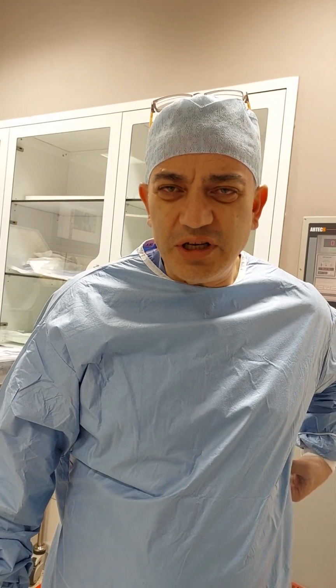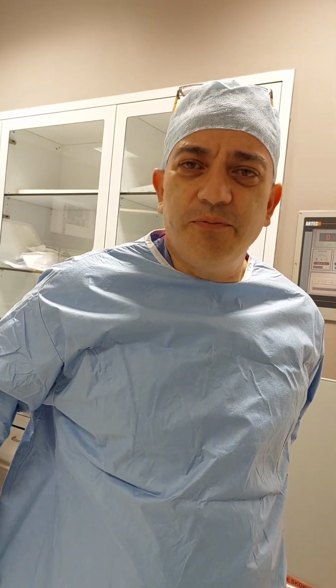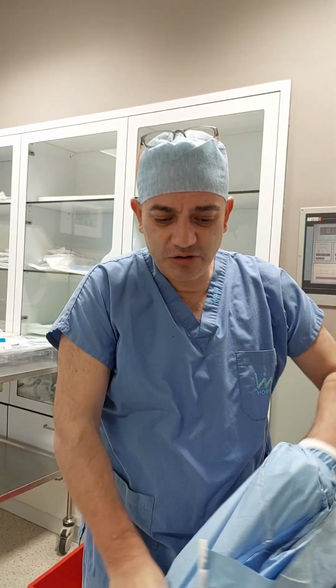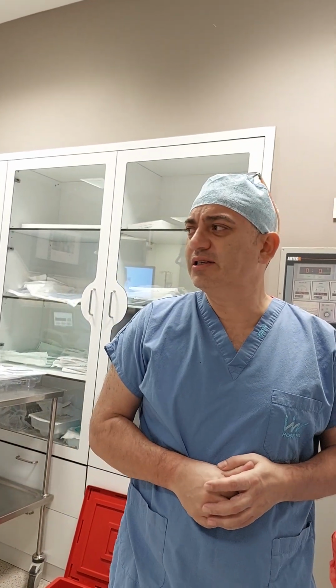We can't use too much steam in these cases, because if for a small prostate we give a lot of steam, this may cause retrograde ejaculation. Normally the retrograde ejaculation ratio is very low in Rezum, but if for a small prostate we give too much steam, there's a risk for retrograde ejaculation too. For his sexual desire, his testosterone levels were decreasing, and he has a huge varicocele too. So we also operated on his varicocele. Although he's 53 years of age, he has a huge varicocele, and in 15 minutes we did a varicocele surgery for him. Now we are expecting the responses.